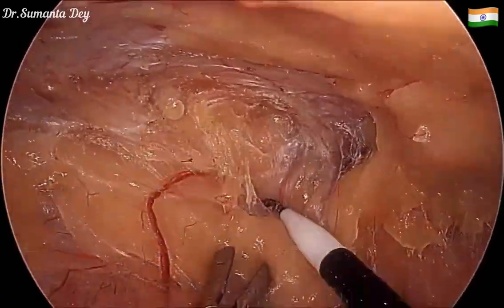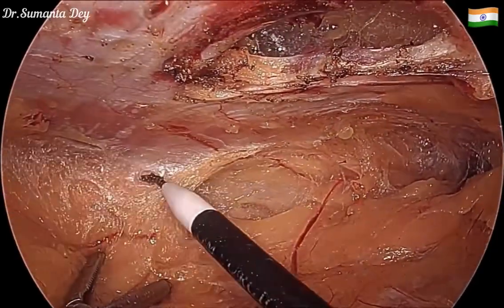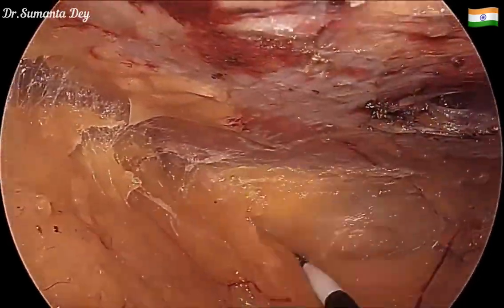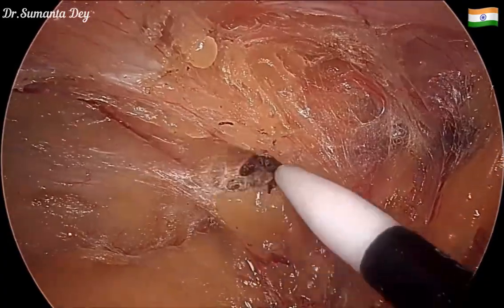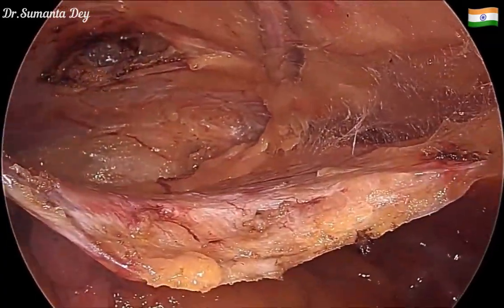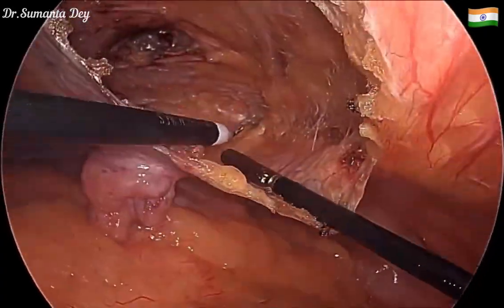Lower down I'll be encountering the cord structures, so limited dissection is required in that area — there was no inguinal hernia in this patient, only a spigelian hernia. You can see the Bogros space is getting created and the extraperitoneal fat is on the lateral abdominal wall.